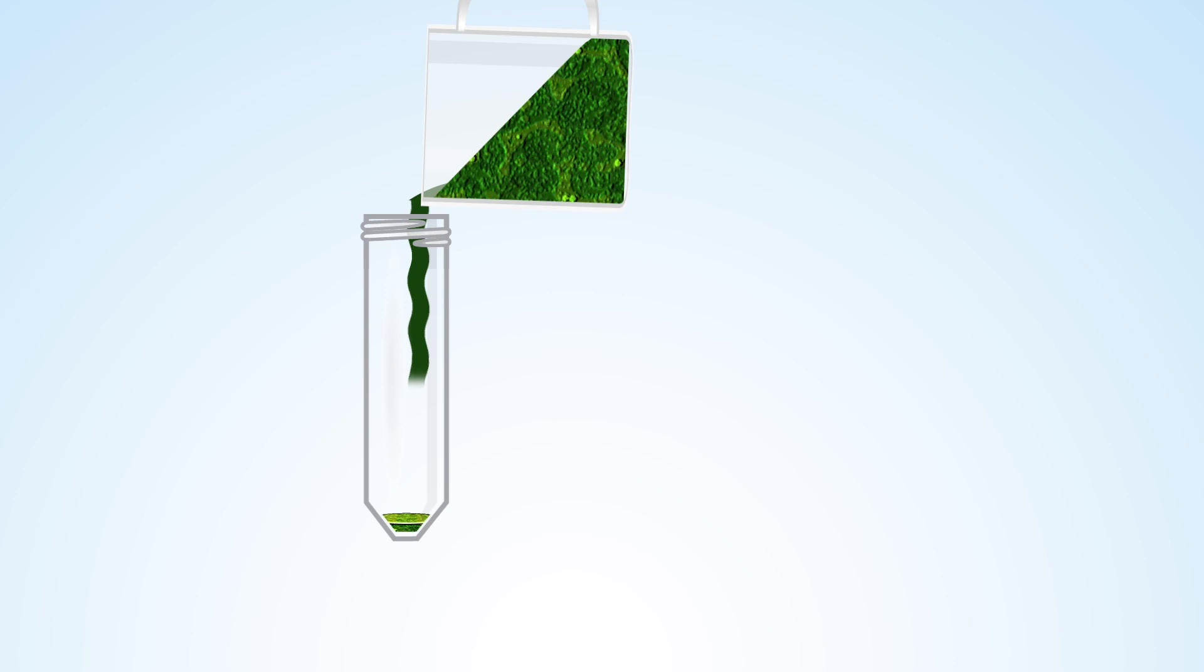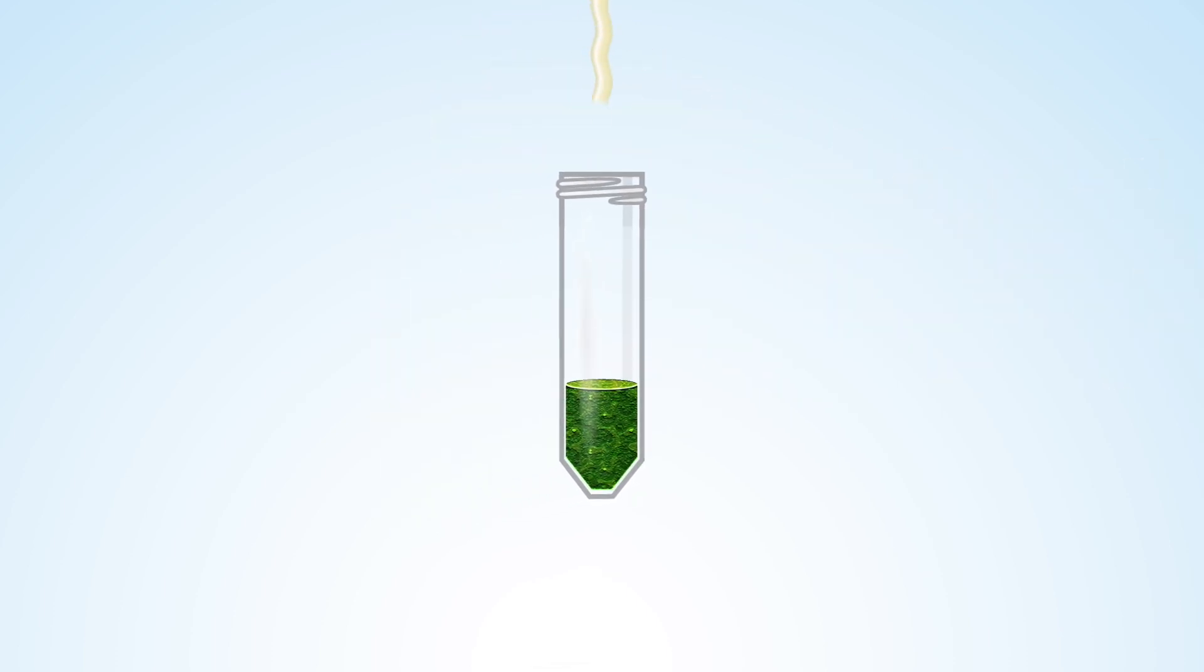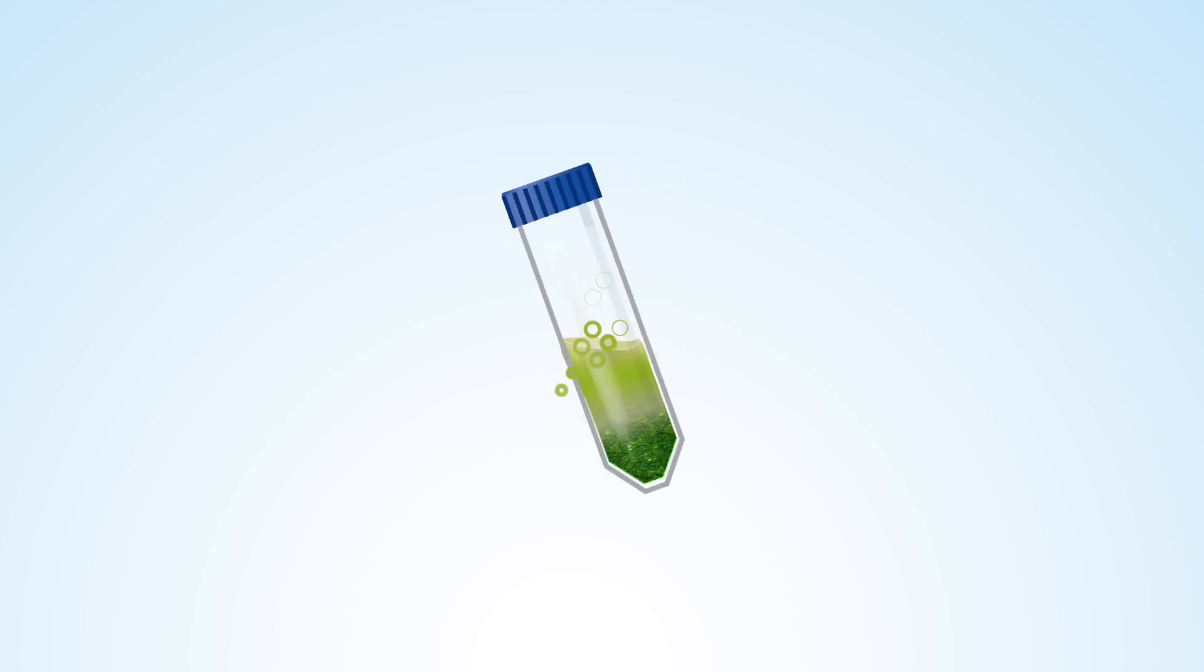Once homogenized, add your sample to a centrifuge tube, then add the solvent, usually acetonitrile, and shake vigorously.